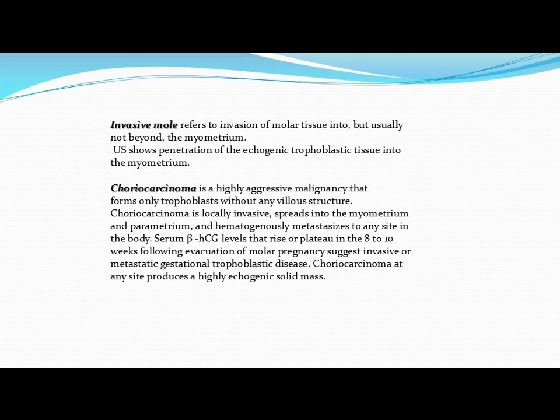Serum beta-hCG levels that rise or plateau in 8 to 10 weeks following evacuation of molar pregnancy suggest invasive or metastatic gestational trophoblastic disease. Choriocarcinoma at any site produces a highly echogenic solid mass.